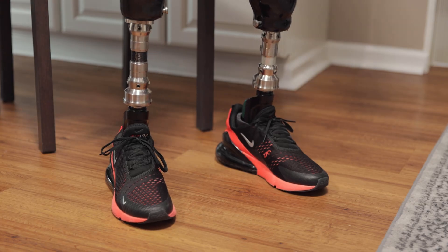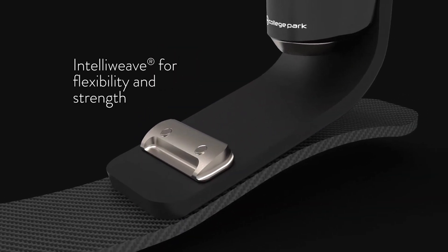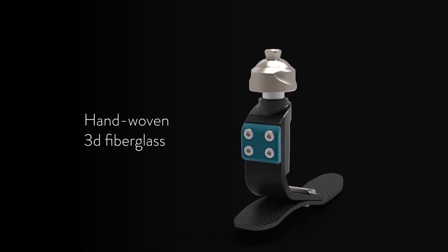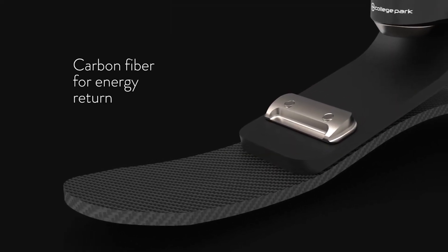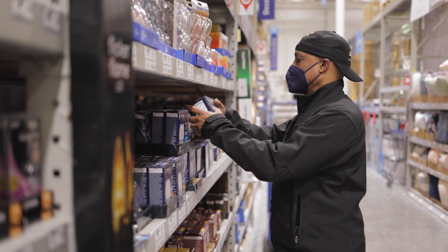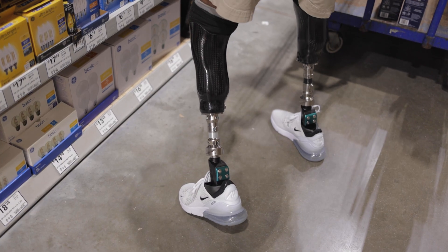The Voyager embraces the best of both worlds. The upper spring is composed of College Park's IntelliWeave composite technology — fibers woven by hand in a 3D pattern for flexibility and strength. The carbon fiber base spring enhances function by providing a dynamic response and increased energy return, making the Voyager responsive and reliable during a wide range of activities.